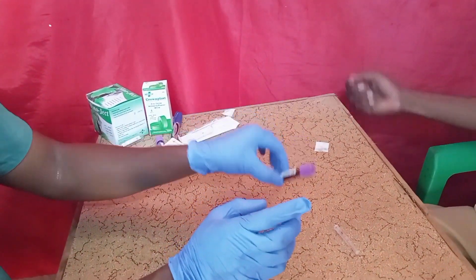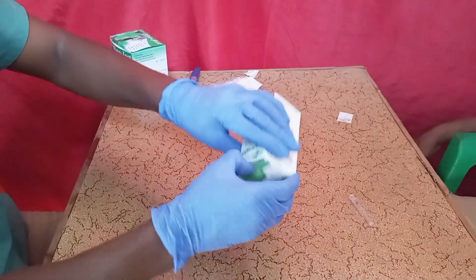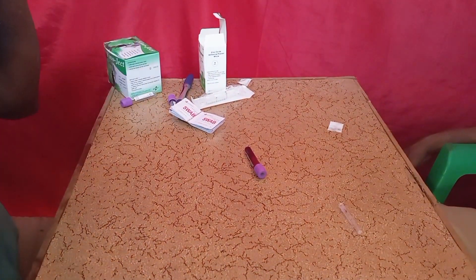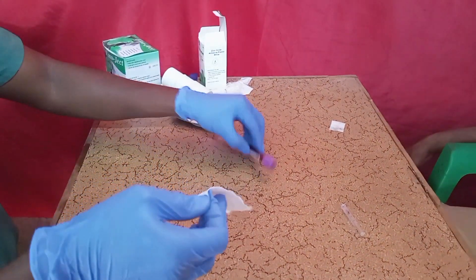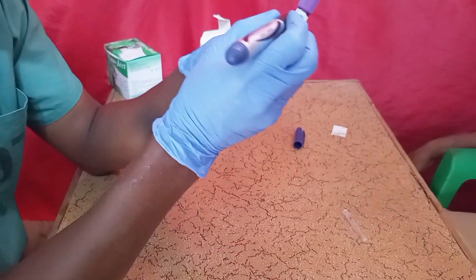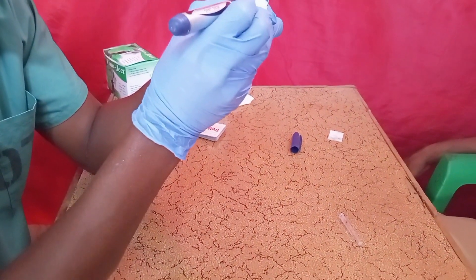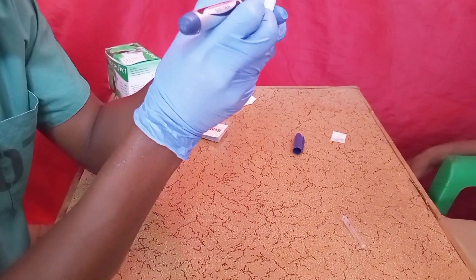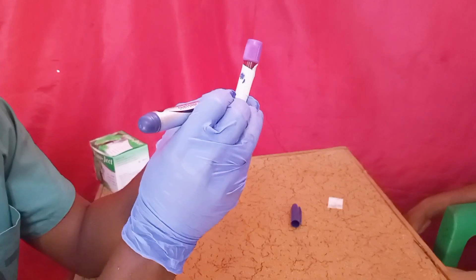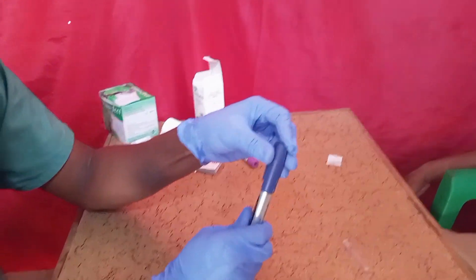After collecting the blood, you have to label the tube with the patient's name, age, and date. You can use a sticker label. Write the name of the patient, the age, and the date. At the end of the session, label the blood collection tube so you can take it to the laboratory for testing.